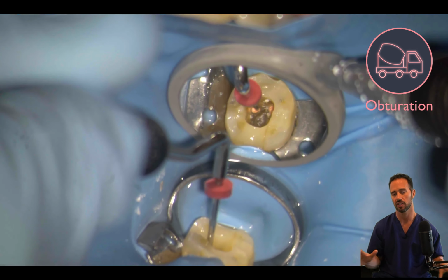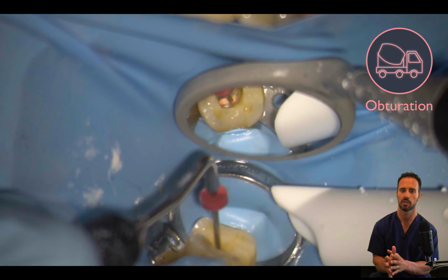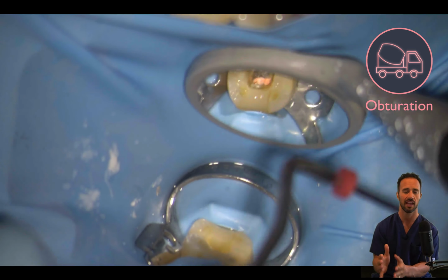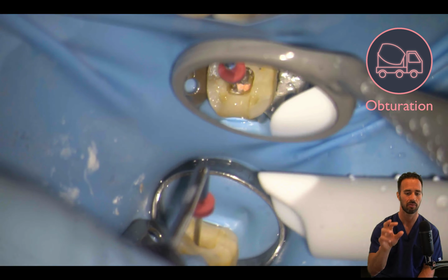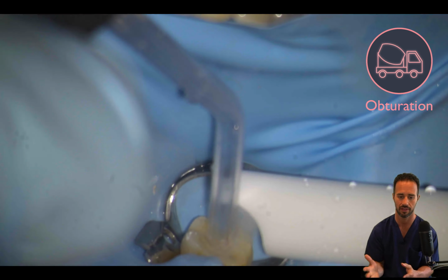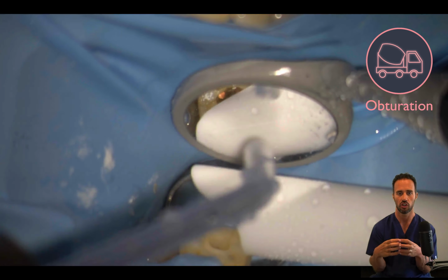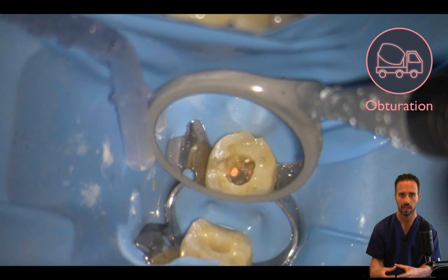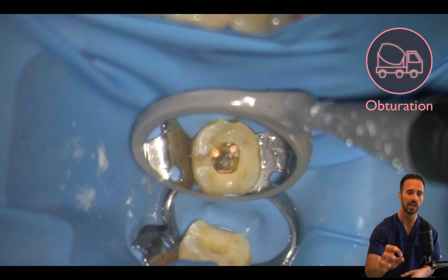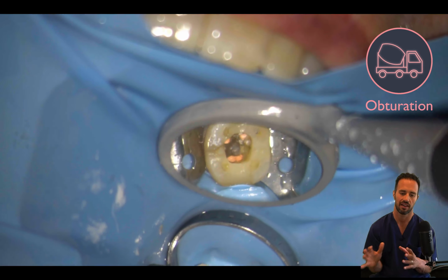And we already know this patient feels good because this is her second appointment. There's no problems. There's nothing that's going to change between when she came in for her appointment today and after. So go ahead and place your core buildup here, no problem if you elect to. It's only going to take you 5 more minutes, and you have a nice area where it's clean, you have a rubber dam on, there's not going to be any leakage of a temporary restoration, so this is a great time. Utilize the extra few minutes and perform your core buildup and do what you got to do.